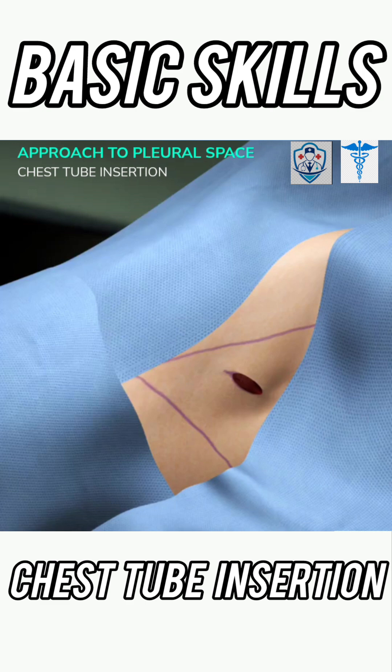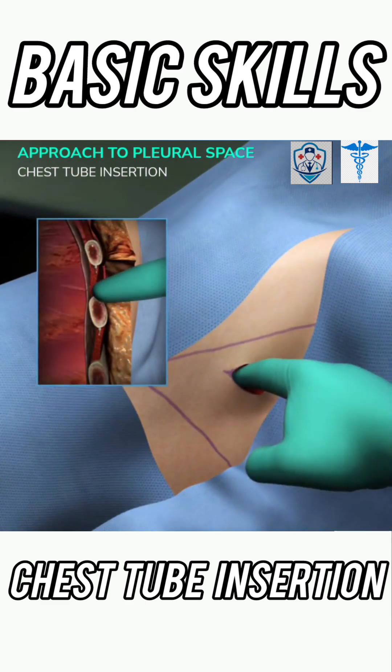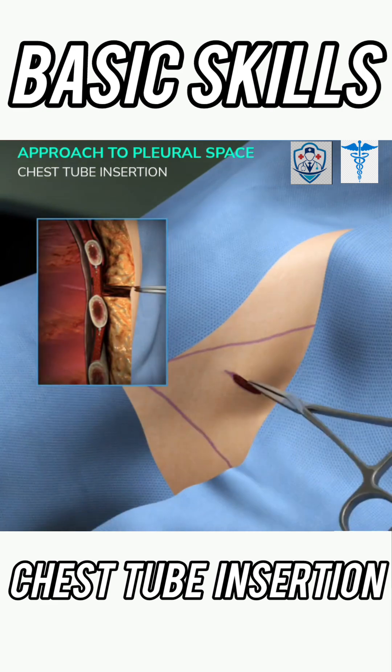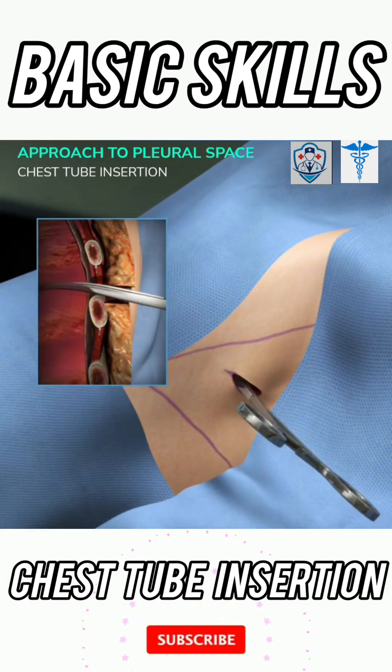With a gloved hand, use your finger to blunt dissect and assess the path created down to the intercostal muscles. This will ensure the large-caliber chest tube will pass through. Then again use the Kelly clamp to blunt dissect down into the parietal pleura.